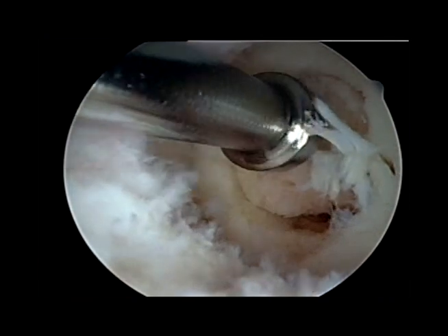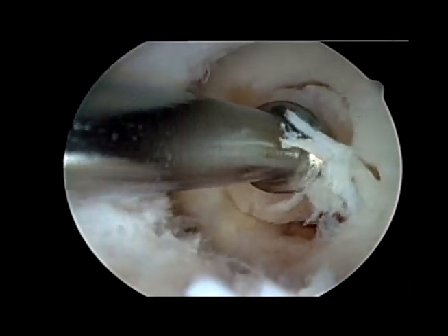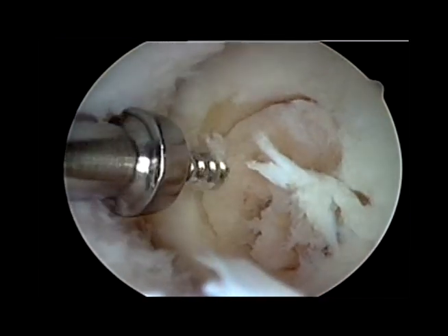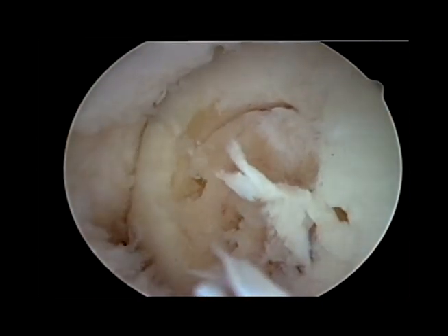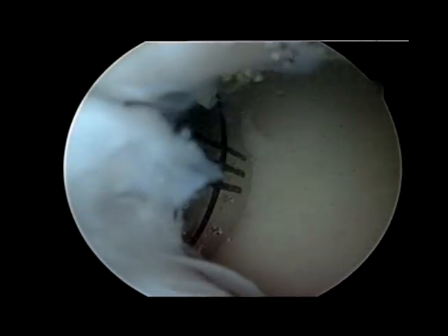We're using this little device here to remove that damaged bone. It may take a few times to get it out perfectly. We'll use a variety of techniques to get this out and then go in with the new cartilage and bone, again using these lines to make it perpendicular.